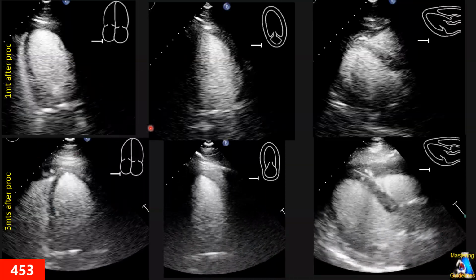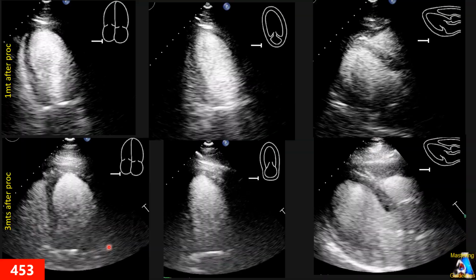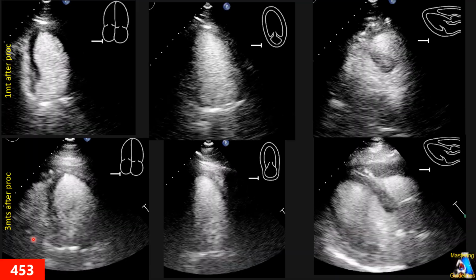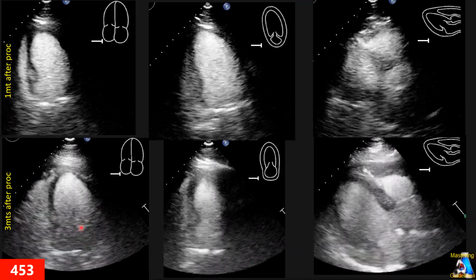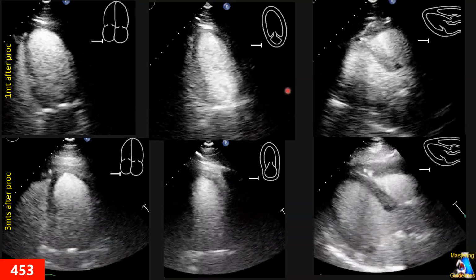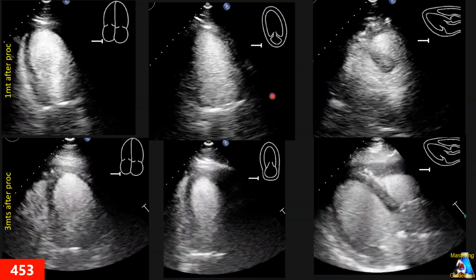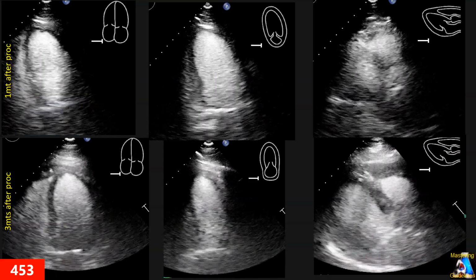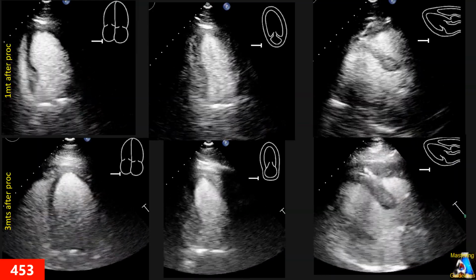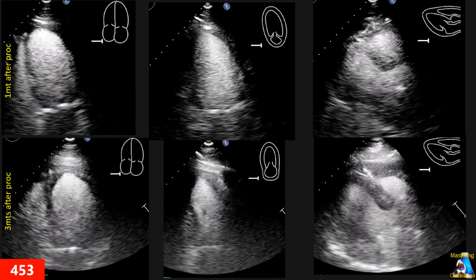Here we have a contrast study on all those views, to review the same 1 month after procedure and the present time, or representation of the patient to the ER. And you can compare, see if you still see those differences, and whether it helps you differentiate the problem and the wall motion abnormality the patient has. Just look at all those views, and most probably you can find it very easily. Now let's go to the next one.